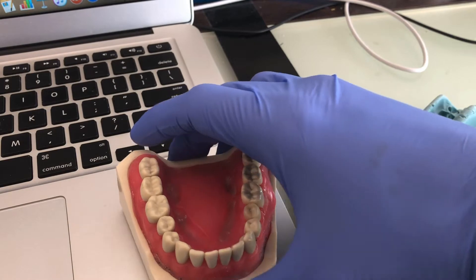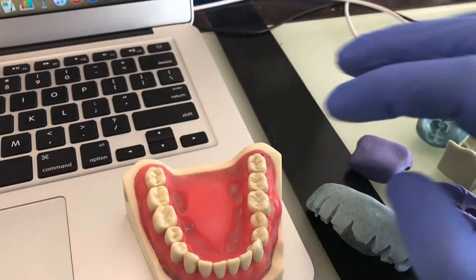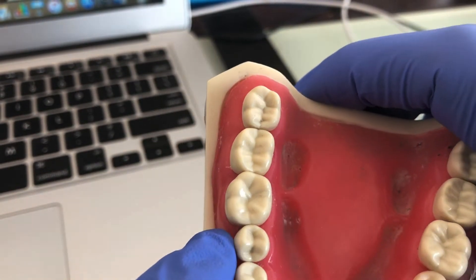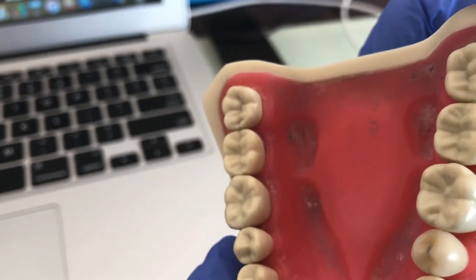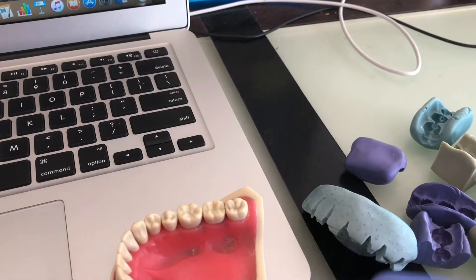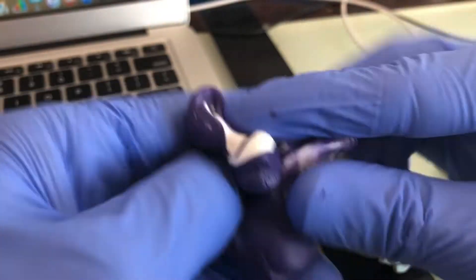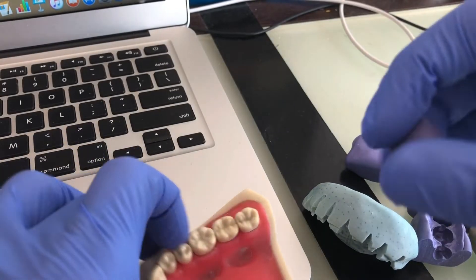I'm going to demonstrate on the four-six, four-five, four-seven area. With posterior teeth you have cusp anatomy that you need to capture very nicely, so this is a good example. Let's start mixing the putty — you need two good equal portions. Just rub it in your hand. The color consistency should be one smooth uniform color; you can't see two different colors when it's properly mixed.